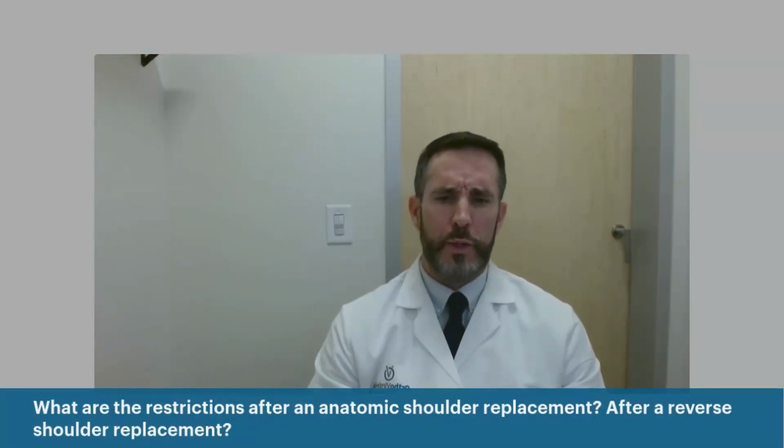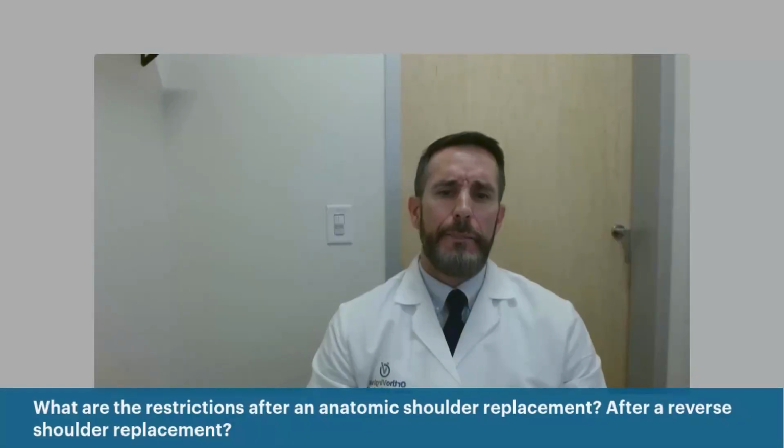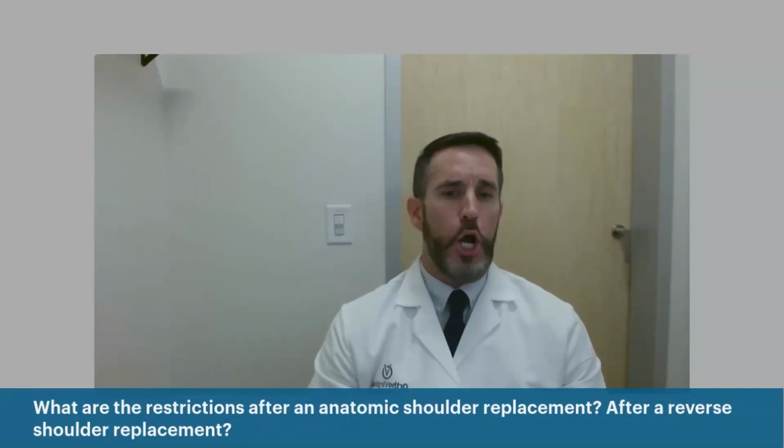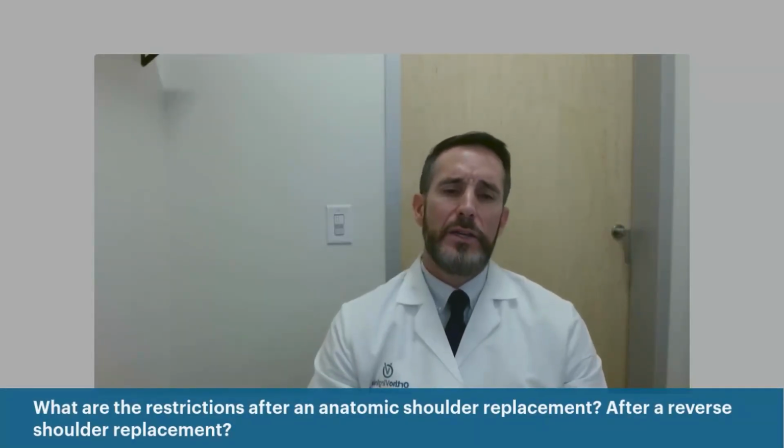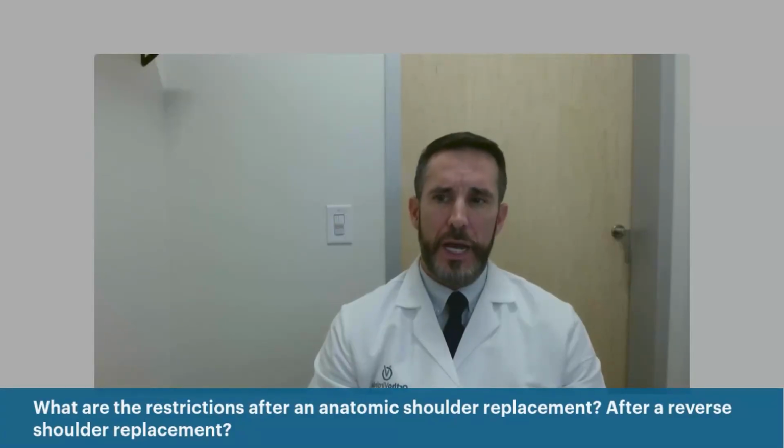After a reverse shoulder replacement, I would caution people for the first 3 to 4 months not to overload the implant. So I would tell people a 5-pound lifting restriction typically. It is a different implant that puts different stressors on the shoulder and scapula.